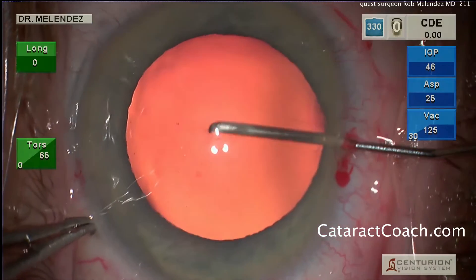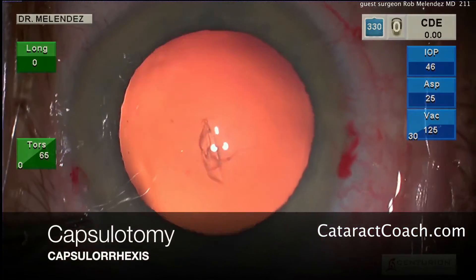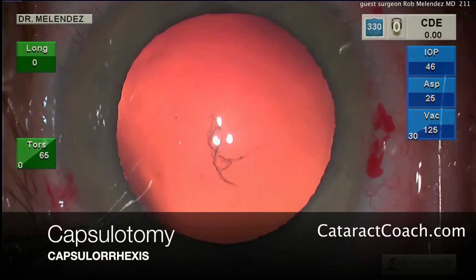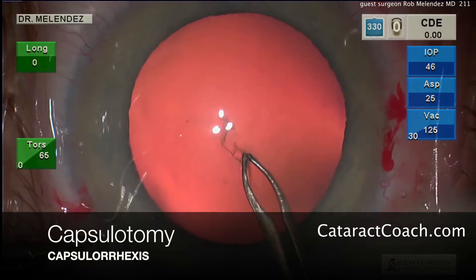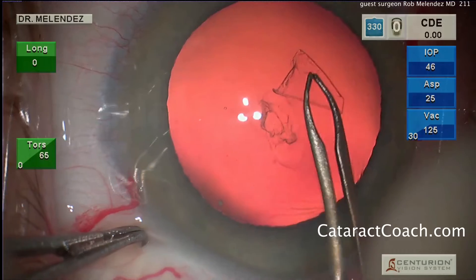To start the capsulorhexis, he's using a cystotome — a bent 27-gauge needle. You'll notice he went through the paracentesis for that, which ensures that the anterior chamber stays formed. Now using forceps, he's creating his capsulotomy, his capsulorhexis.